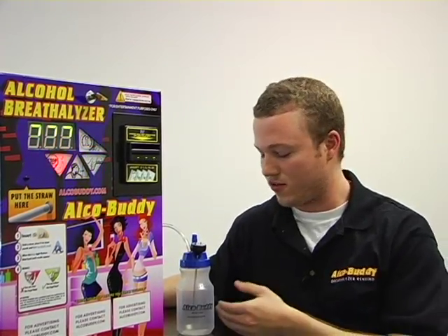Hello, welcome to the AlcoBuddy calibration video. The first step in calibrating the AlcoBuddy is creating the solution.